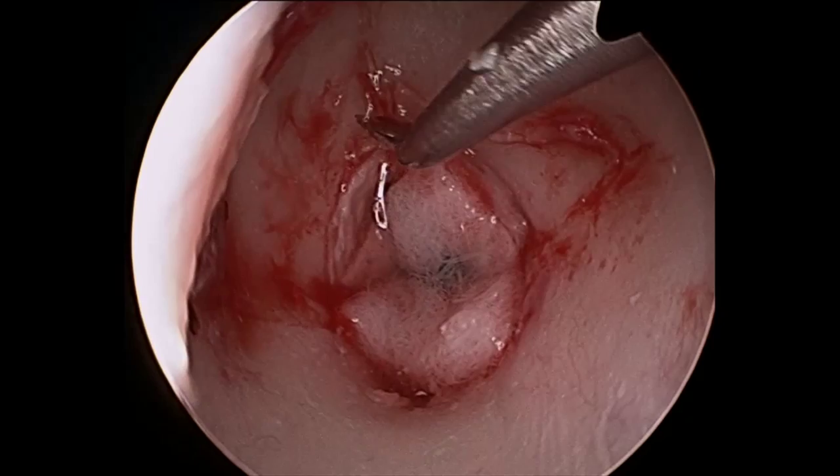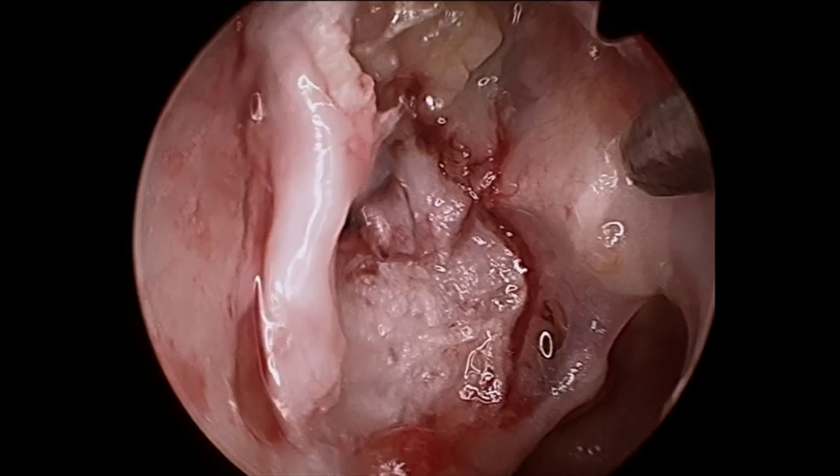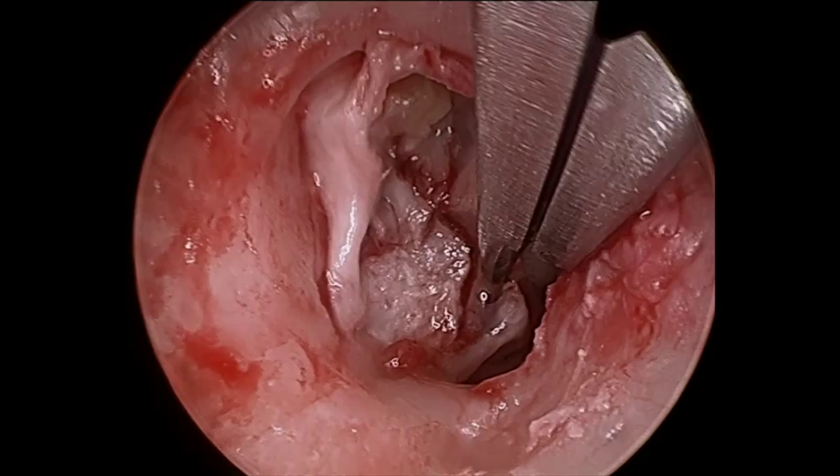The operation begins in the usual manner by elevating the skin flap, and the cholesteatoma is dissected with round knives. The incudomalleolar complex can be seen anteriorly, and the scar band attaching to the stapes is divided.